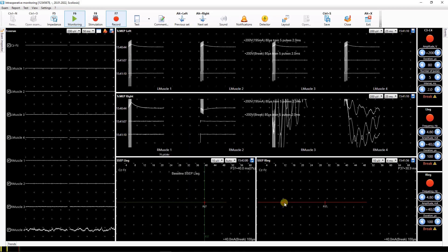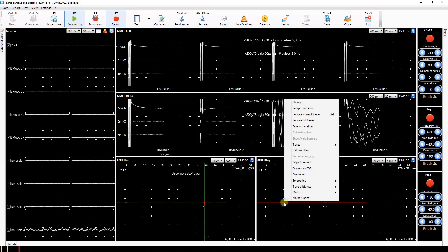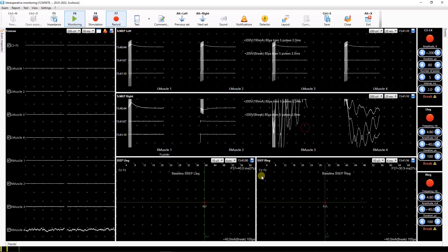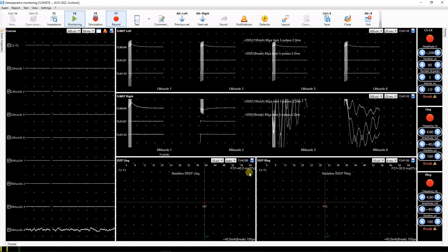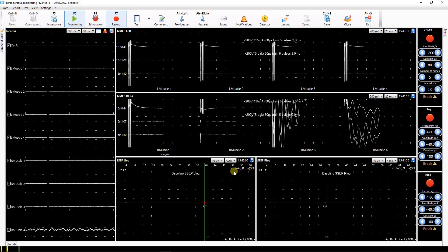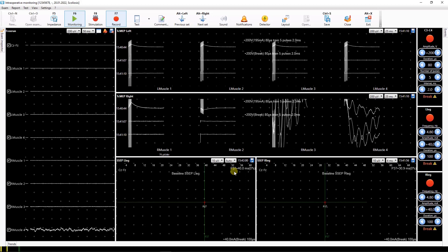After that, baseline traces will display green. If the window contains calculated parameters, the deviation of its current value from the baseline value is shown in percent for each parameter.